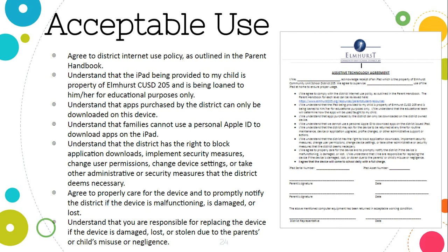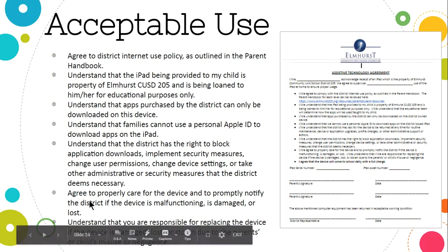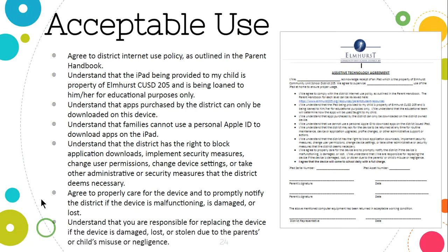You agree to properly care for the device and to notify the district if it's not working, damaged or lost. So, we ask that you not take it somewhere like the beach or the pool if your child goes to swimming lessons. If you need some additional support in those areas, you can go ahead and let me know. If we had met in person, I would have had some low-tech supports for you to take home in case it dies unexpectedly, or you are going somewhere where you don't want to take it, like the pool or something like that. So we just ask that you take good care of it and make sure that it's working well.